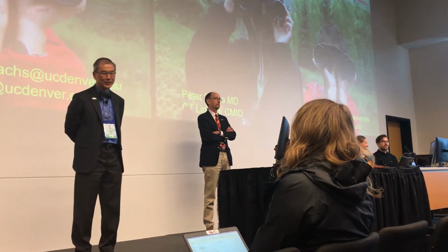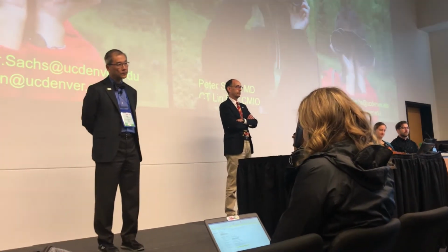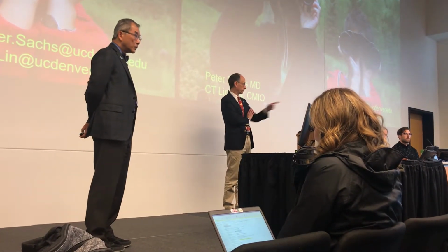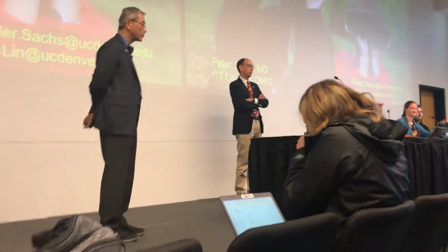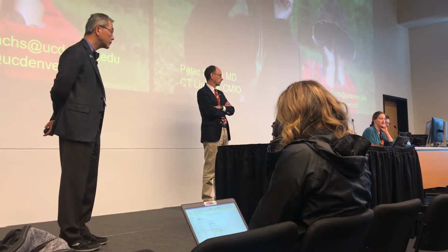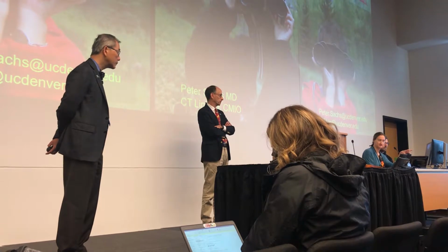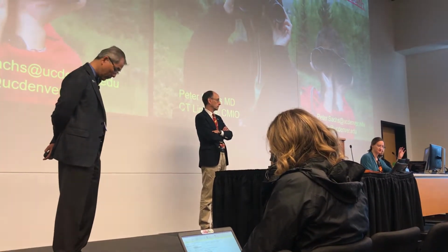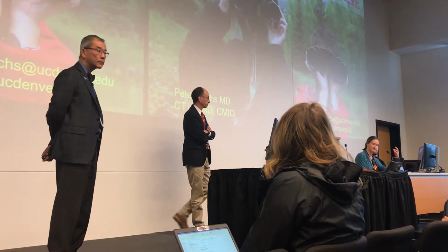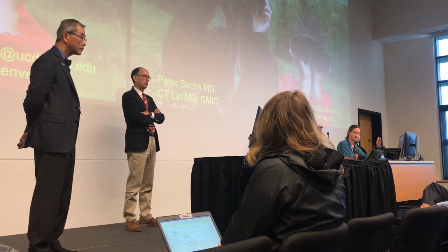All right. So I have some security questions. You have people hitting your image servers from their home PCs. I see that you're passing generic credentials. Who am I looking at for this question? I see you're passing generic credentials, and I'm assuming that's Active Directory driven to get the correct viewer. So the credentials only authenticate into the Philips Viewer. Okay. So it's only credentials for that, simply created in that system. Similar to what a lot of organizations do for regular fax viewing or for Epic Care Link, where you don't necessarily need to have an account for every single person. Right. You just use one.